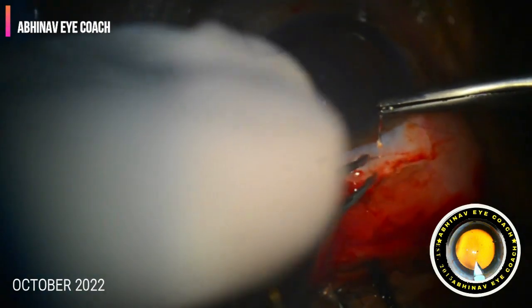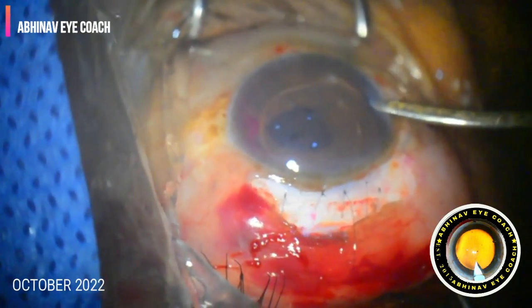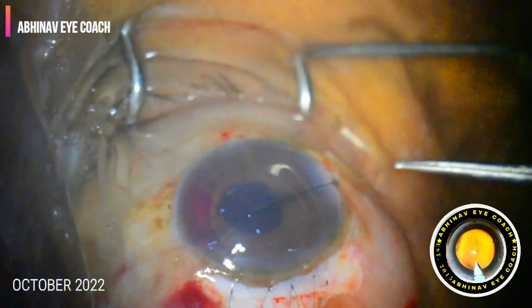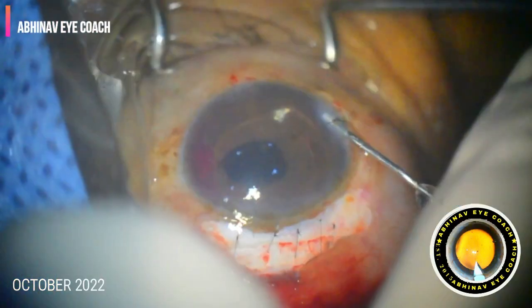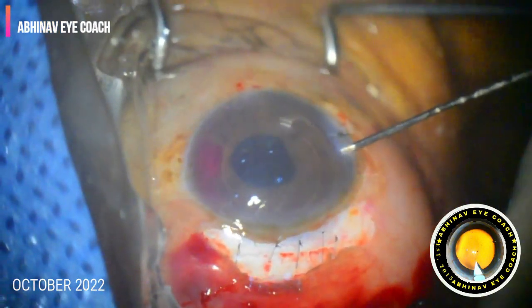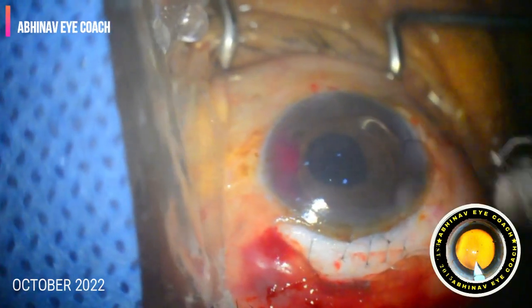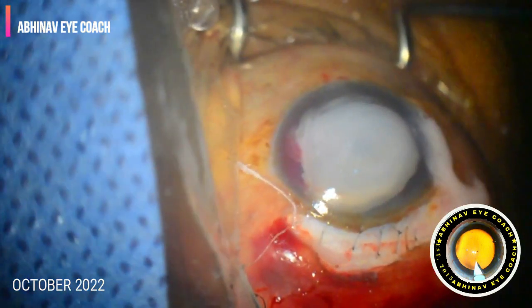There is a little bit of hyphema from bleeding coming from the pockets of the tunnel. We sutured the tunnel, giving three to four sutures with 10-0 nylon. We also sutured the main port made for performing the phacoemulsification. The anterior chamber is well formed and we can see there is no leak. Here we close the case.